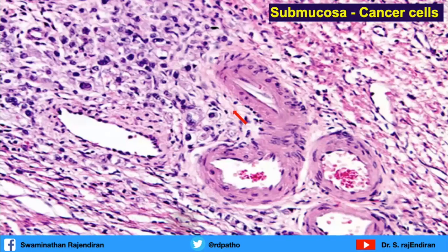Here another tricky thing, this is submucosa and you can see the poorly differentiated cancer cells. Okay, and these are invasive carcinoma. Now you know, see this number of blood vessels there. That's why we need the cancer cell to come into the submucosa to call it as cancer, because the incidence of metastasis is very high once they come into the submucosa.